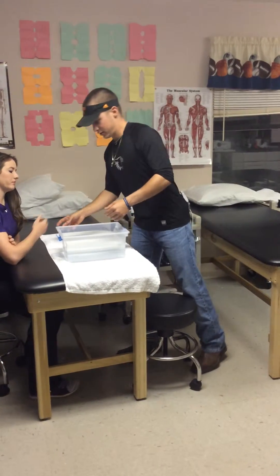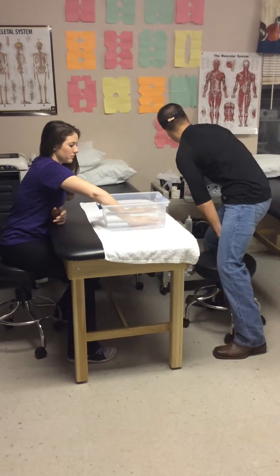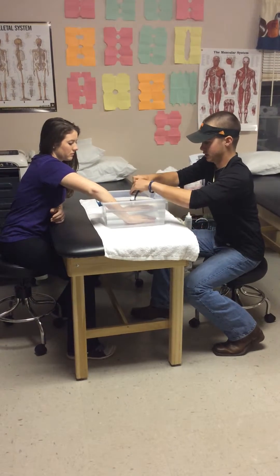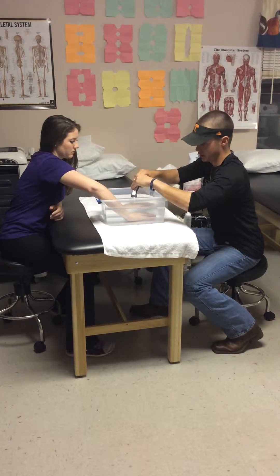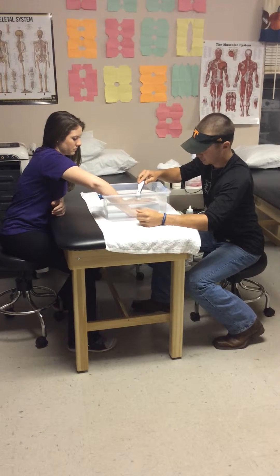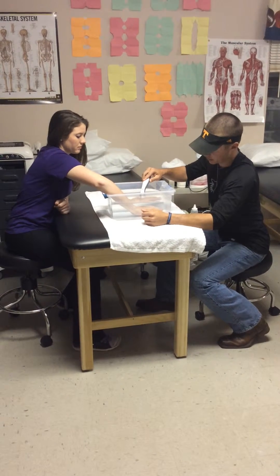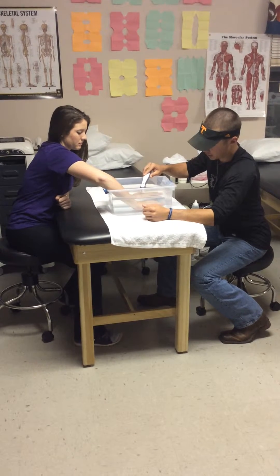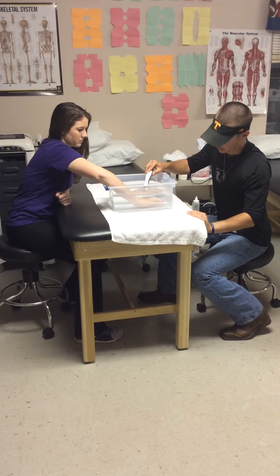Now I'll place her hand into the water, then take the ultrasound head and place it into the water as well. I'll start the modality and begin moving in a circular motion, keeping the ultrasound head 0.5 to 1 centimeter away from the skin. The ultrasound head should be covering 4 centimeters per second.